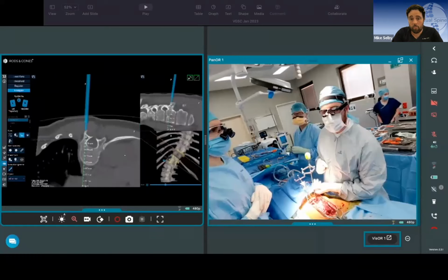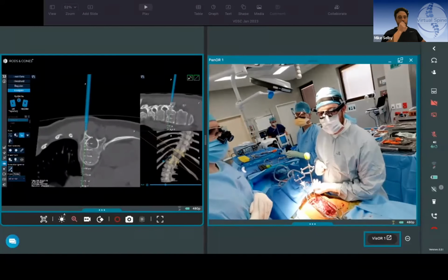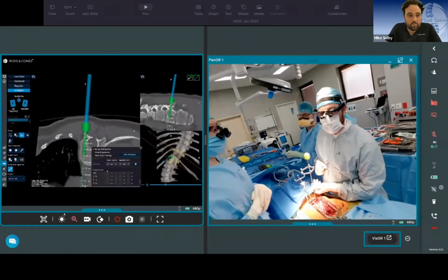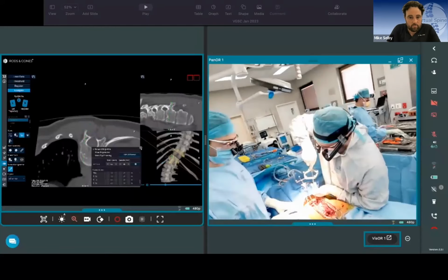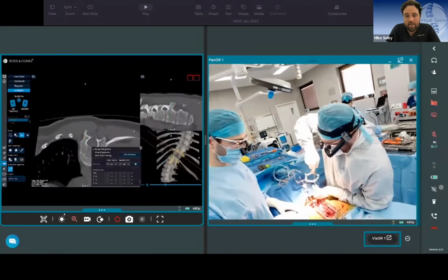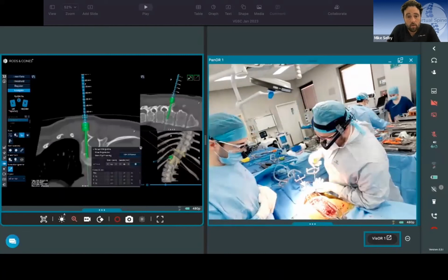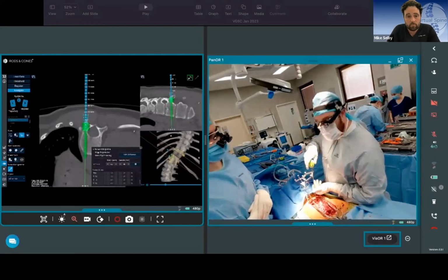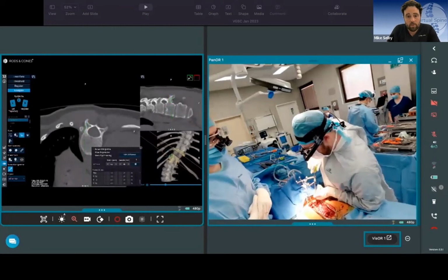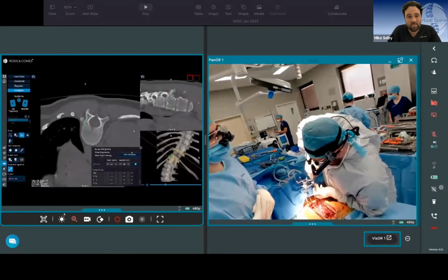So this is just a video of pedicle cannulation and how you can do it with workflow. Like a lot of systems, you can just plan. So you just touch the bone. Can we put a projection on there? 45? Yeah. And I'm doing freehand here, but for the tighter pedicles, I use the burr. It helps save my wrist. You can use burr all the way if you want, or power tools. Let's go reverse projection now. You can see on the scan the Scheuermann's in her thoracic spine. So to get that nice anatomy there.